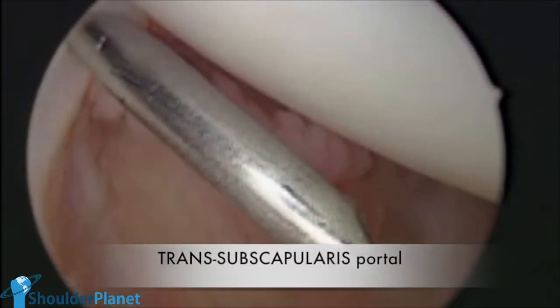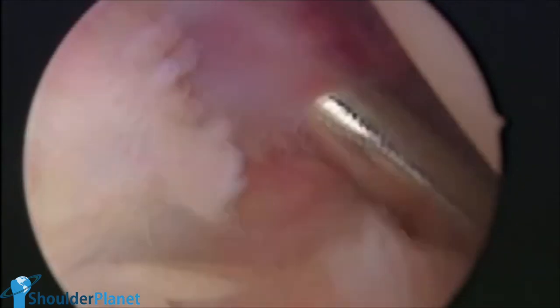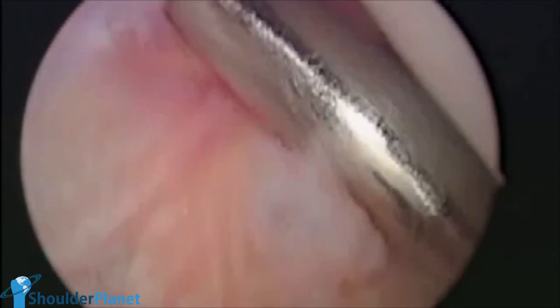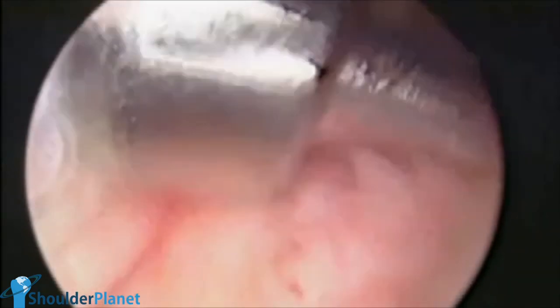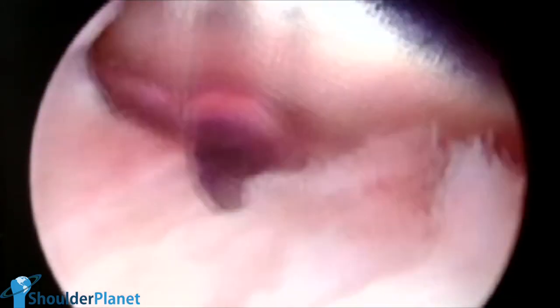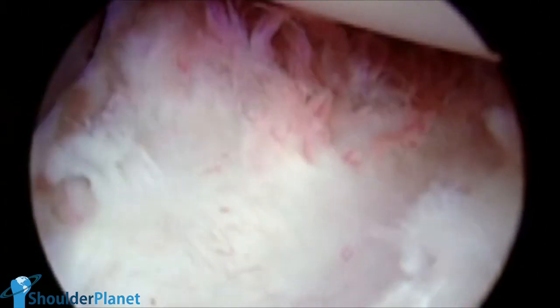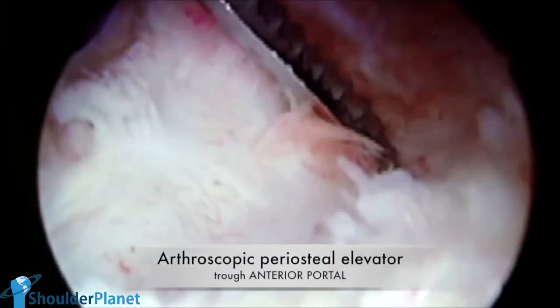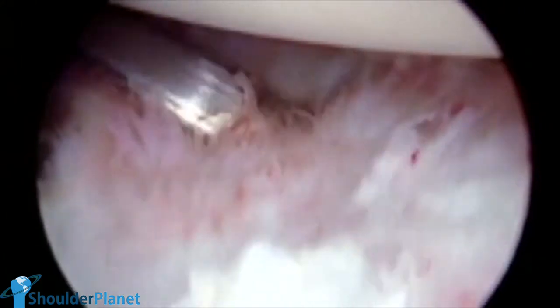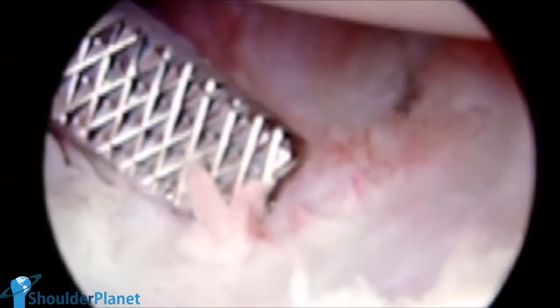We had to establish a trans-subscapularis portal, which is quite difficult, but we finally did it with a spinal needle, then we entered with a Wissinger device. Using the Wissinger and putting some strength in our hands, seeing the upper border of the subscapularis, we could finally enter with a standard cannula. This is quite difficult because the subscapularis is a very strong tendon and muscle, especially in such a strong man. When the cannula was in place, we entered through the anterior portal with a very delicate spatula and osteotome to try to find the HAGL lesion. Here's the HAGL lesion — we've seen a torn ligament at its humeral insertion, and the delicate osteotome was entering through that rupture, that torn ligament.